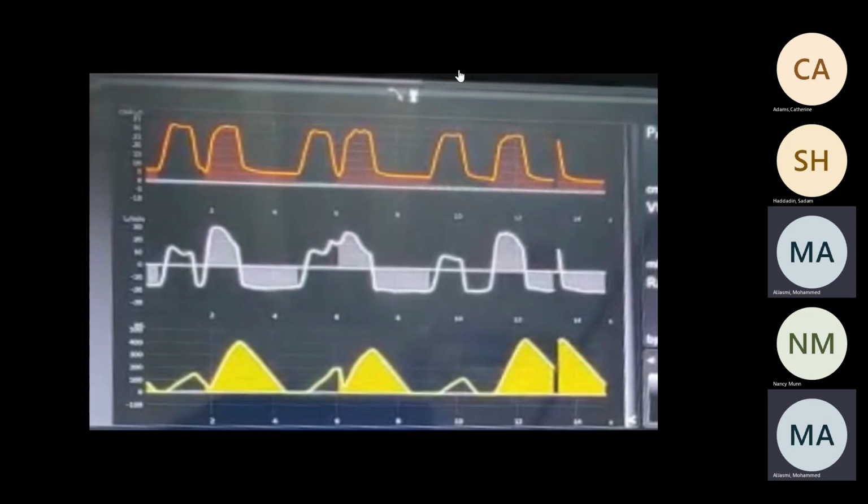Got it? I still struggle with the flow, like when I set the ventilator, especially at St. Mary. How could I decide on the flow, like 25 liters, 30, 60? When you change the flow, it will change.